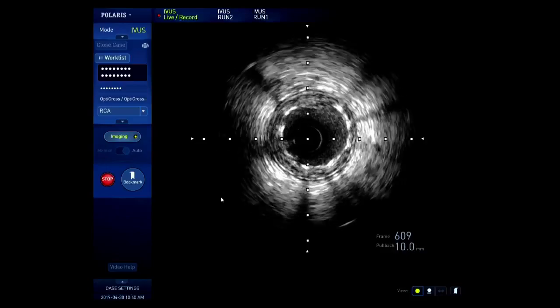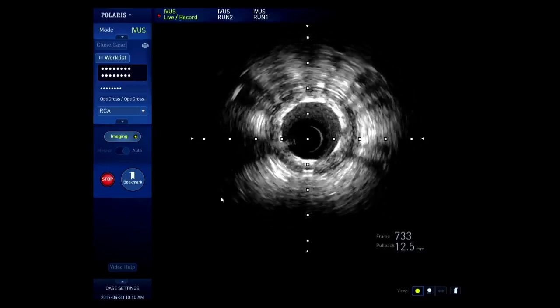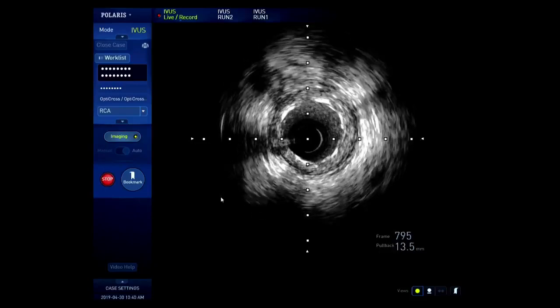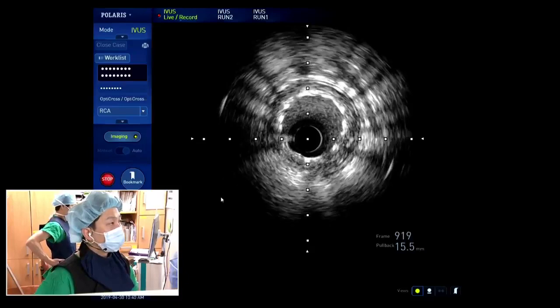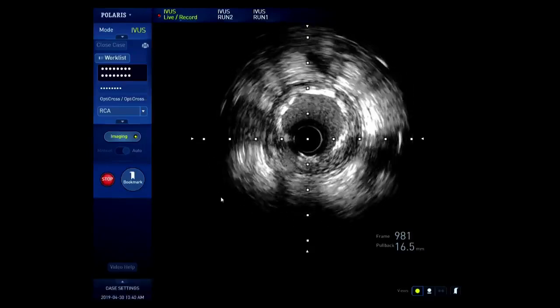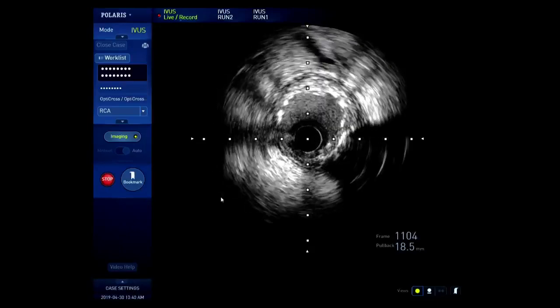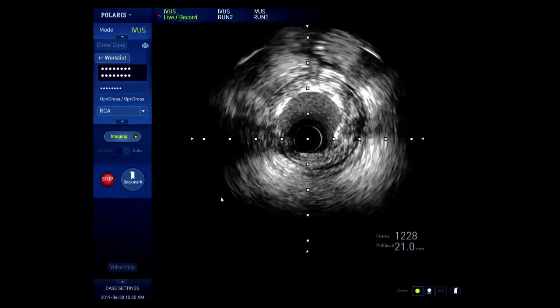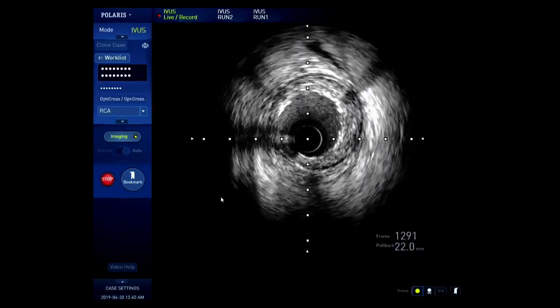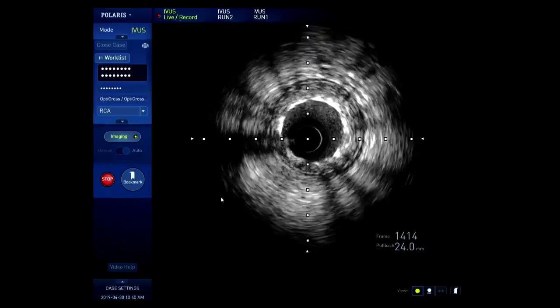Distal plaque burden is 48%. Proximal plaque burden is 53%, which predicts edge restenosis. So I think the best landing zone is a plaque burden of less than 50% and a stent cross-section area of more than 4.9 to make a good result. To make a stent cross-section area more than 4.9, you need a stent diameter more than 2.5, is that right?